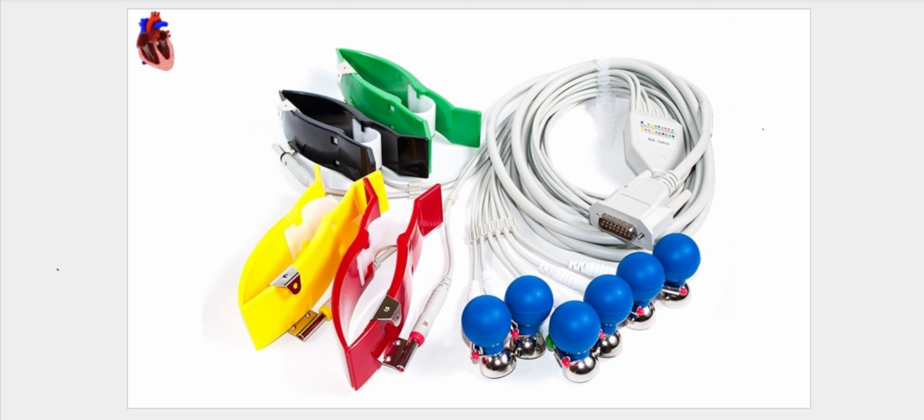This is very important because it normally gives a comprehensive view of the heart's electrical activity, at least from different angles. Each lead gives a unique perspective, helping to localize problems within the heart. So they are very important.